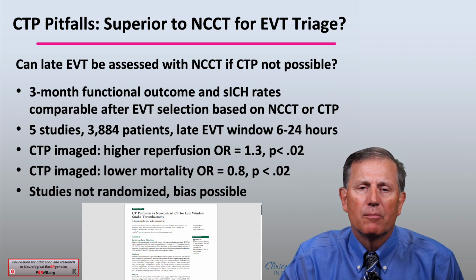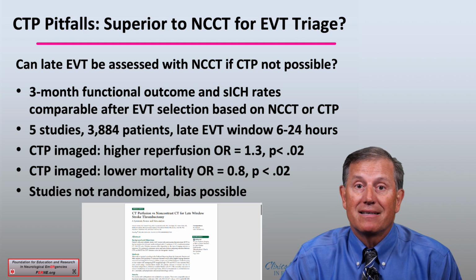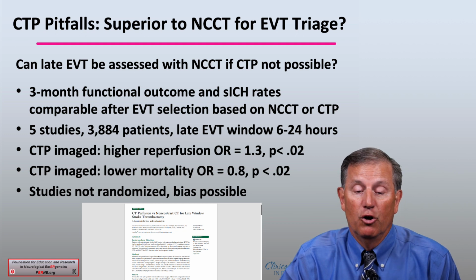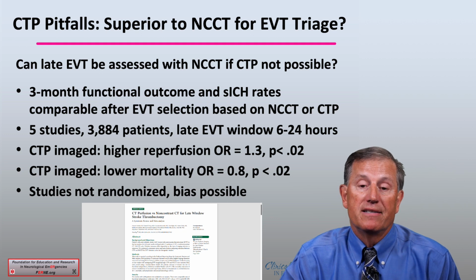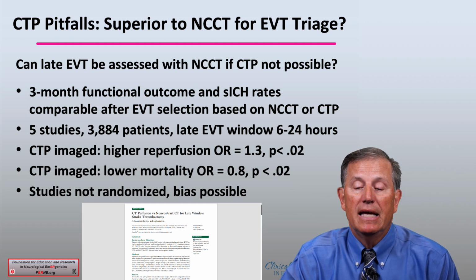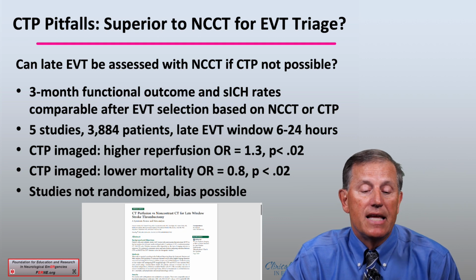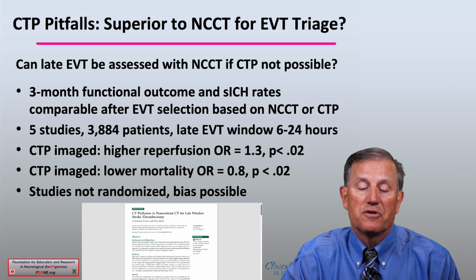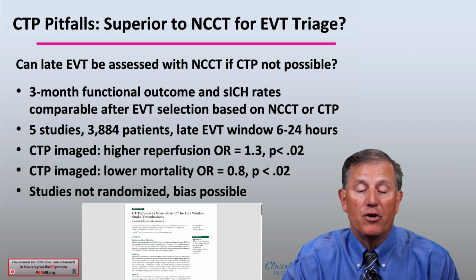So is it possible that the use of late EVT can be successfully determined with a non-contrast CT for those of you who work in centers where CT perfusion is not possible? Again, from a study listed here, the 3-month functional outcome and symptomatic intracerebral hemorrhage rates were comparable after EVT selection based on either the non-contrast CT or CT perfusion.